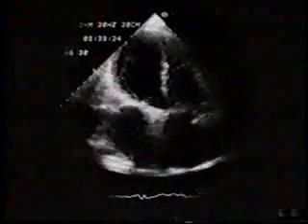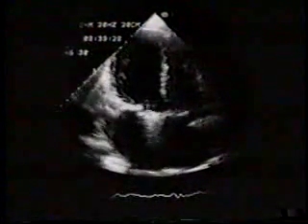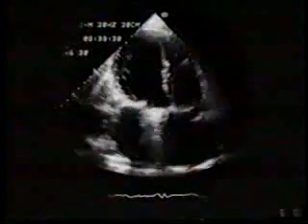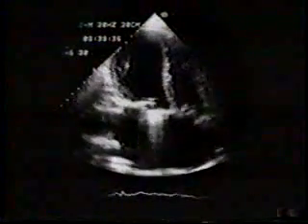Although the cusps appear somewhat echodense, the opening is normal and there is no prolapse. This 73-year-old male also has a tricuspid heterographed prosthesis.